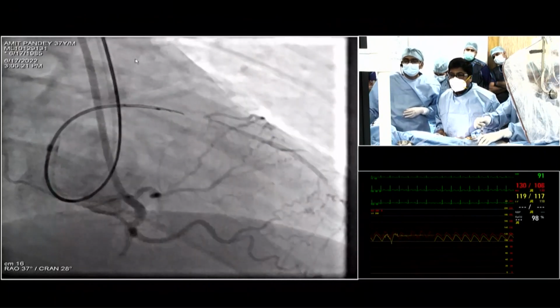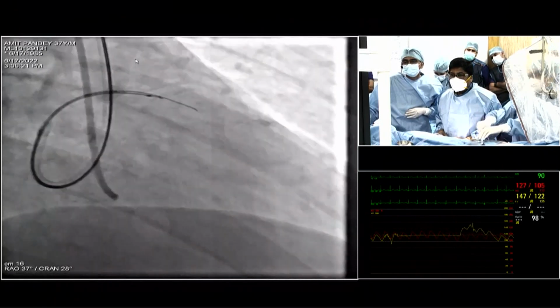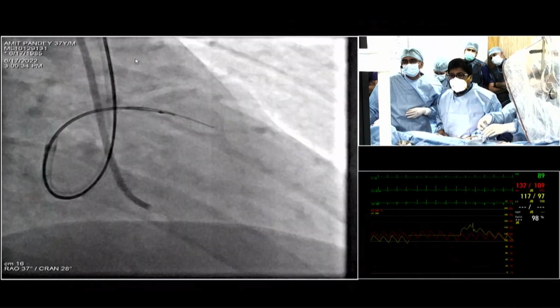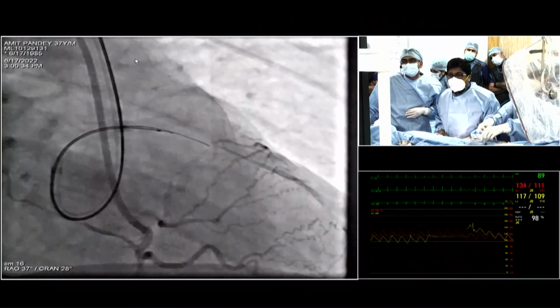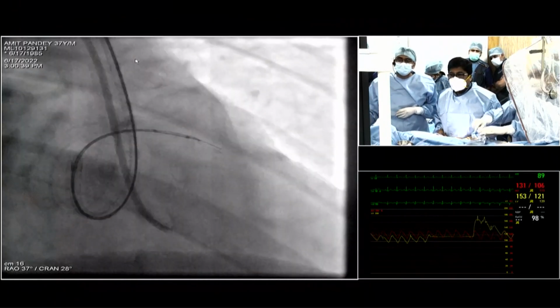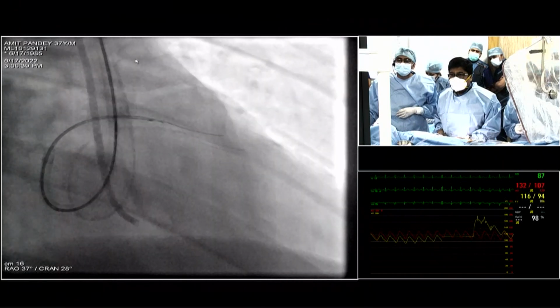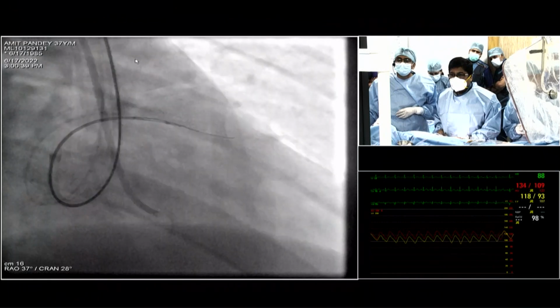But now the question is, we don't know if it's truly penetrating and going down. With the Conquest Pro, I think he's just reaching. This is the situation where all the cardiologists fail, using the same track, just reaching, and then you cannot. You will be tempted to do much more during that activity. That's why you are suggesting a caudal view also in this case. But looks like he's just gotten somewhere.